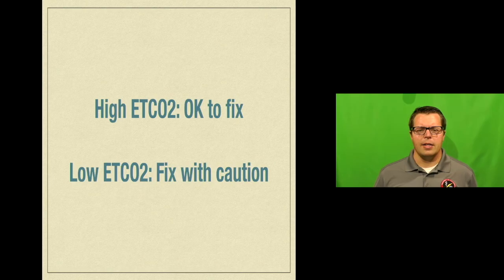If the patient has a low end-tidal CO2, you have to be very cautious when you fix it, because if that patient's in shock or is acidotic or has bad DKA or whatever their individual pH problem may be, if you try to fix a low end-tidal CO2, you may kill the patient when you do so. So use caution with that.